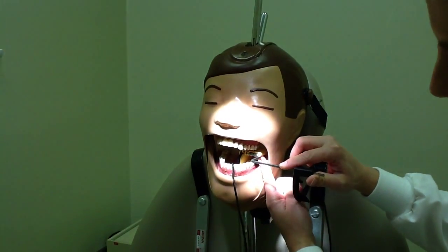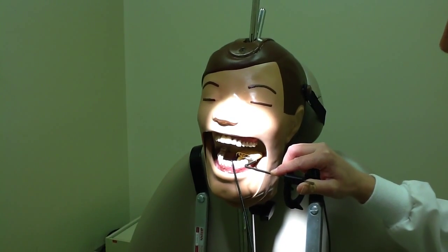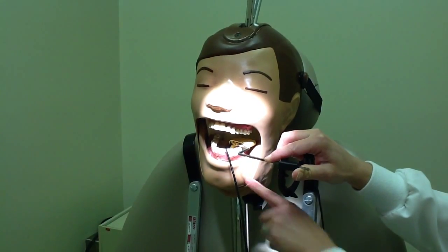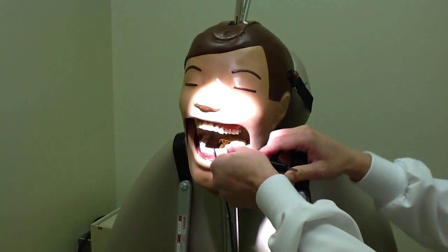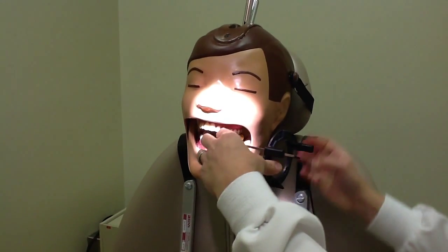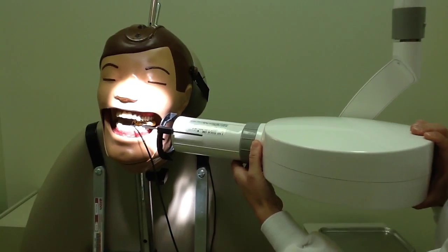So this is the bite block. We want this bite block to be touching the tooth. I'm going to slowly and gently push it down, and that'll guarantee that we're going to get all the way down so we can get the apex of the teeth. Okay, so now that it's closed down, we're going to support it and seat it. We'll have the patient slowly close down, and then we'll line up our XCP kit as close to the cheek as possible, and then we'll line up our PID.